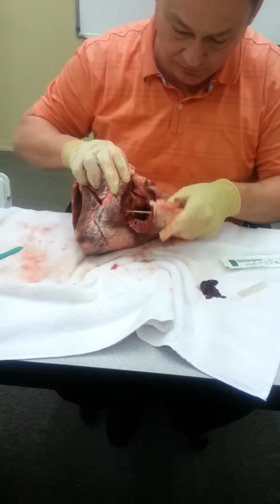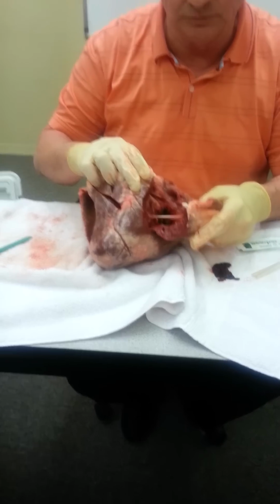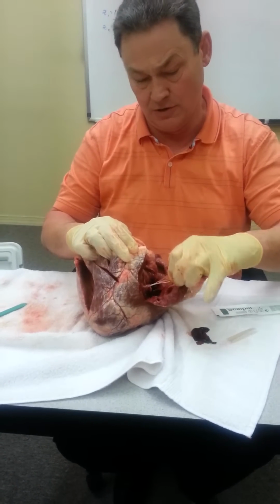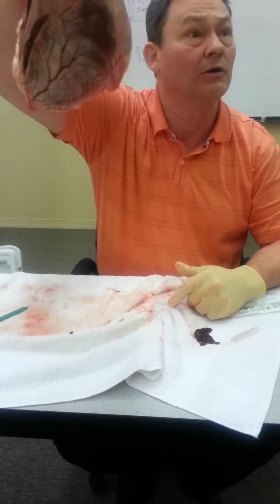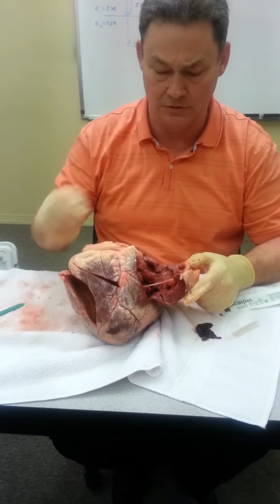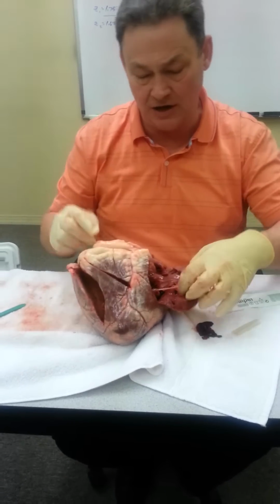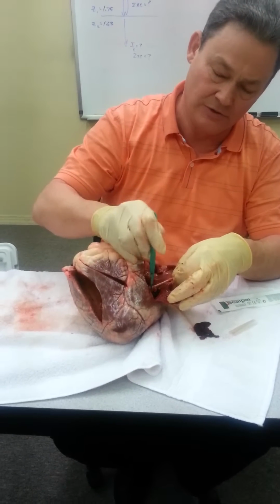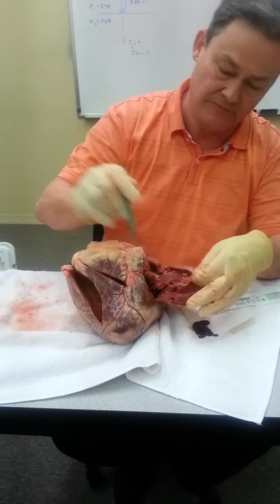Is that one big strand compiled of many little? Now this is actually multiple, see? You can see there. But they're pretty strong. Very strong. So it's not likely that they're going to come apart. Take that muscle off of there so you can, let's come from this side.